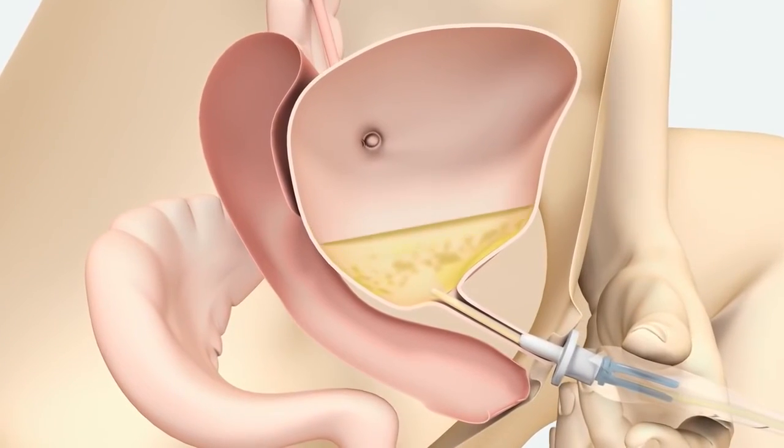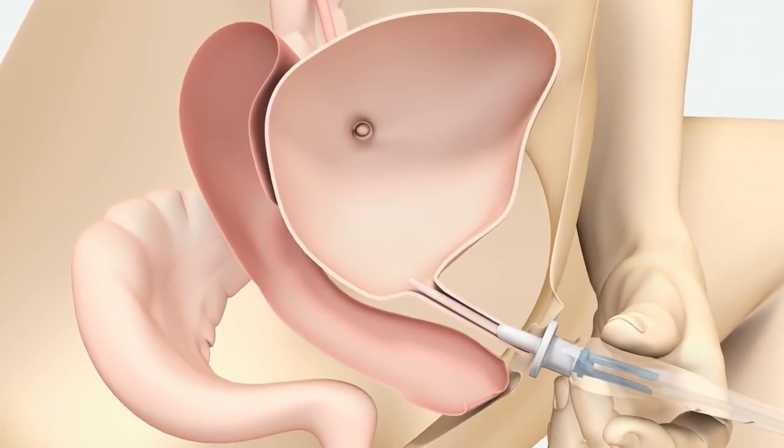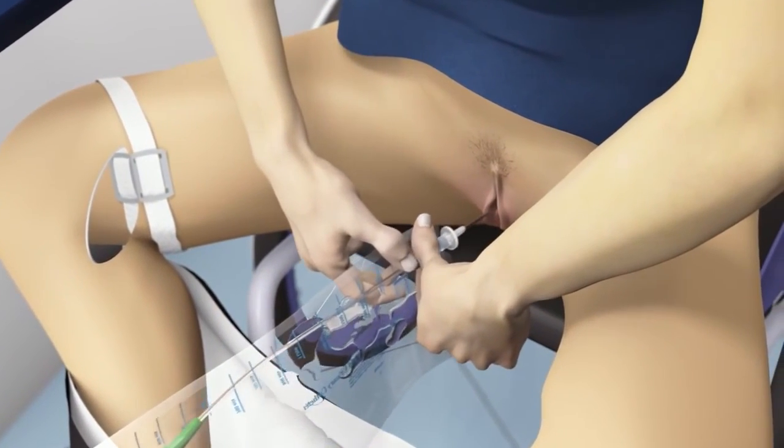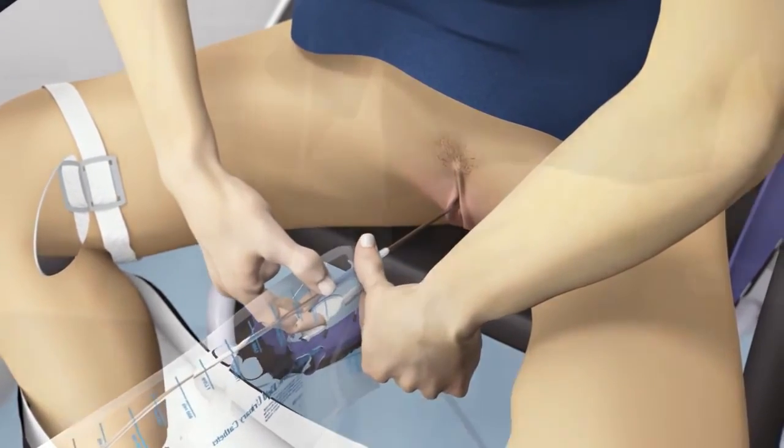Continue advancing the catheter until the catheter has entered the bladder and urine begins to flow. After the urine stops flowing, gently remove the catheter with the bag attached.